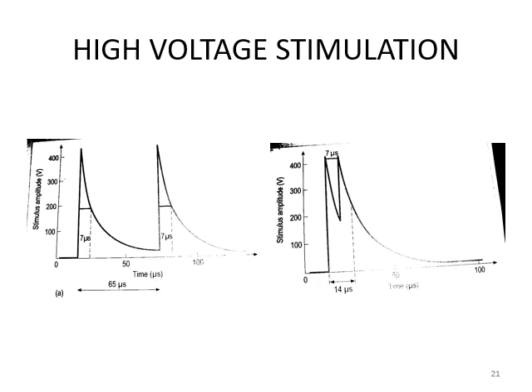So there is a sudden rise followed by gradual decline, and after around 65 microseconds, the second peak comes, followed by again a gradual decline, and around 65 into 2, that is 130 microseconds, the pulse is over, followed by the complete rest for a very long time. So this is one example, and the average effective pulse duration is 65 microseconds, and for each peak, the peak intensity usually remains for around 7 microseconds, which is the effective time.